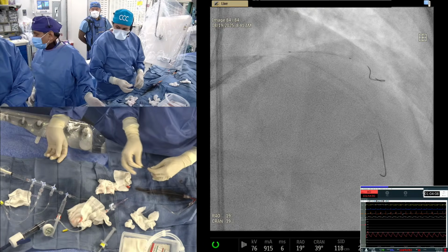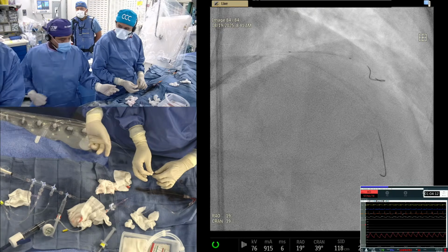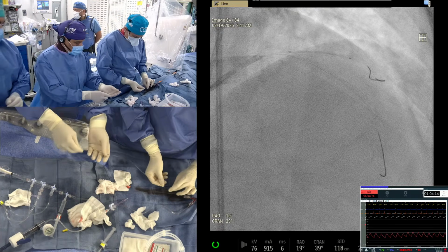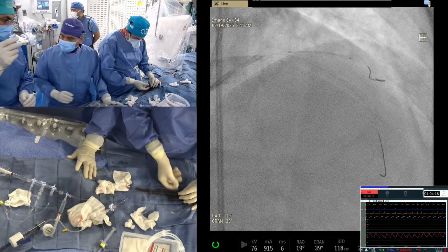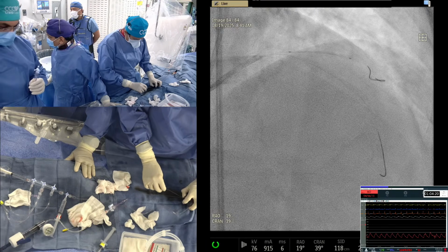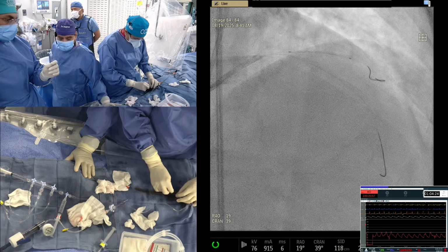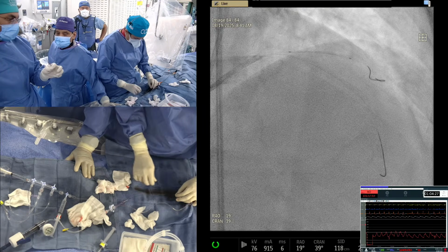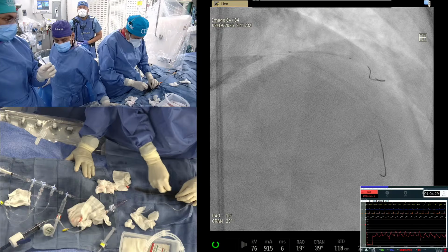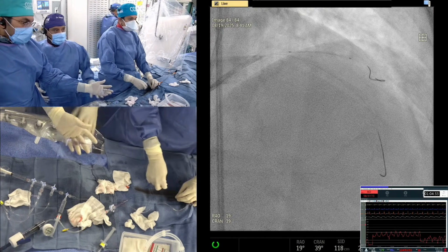It's Biotronik. And Biotronik has now been taken up by what is the main parent company now? Teleflex. Yeah. Biotronik has been acquired by Teleflex. And Nikhil has written here, Orsiro bought by Teleflex. Yeah. Biotronik, yes.